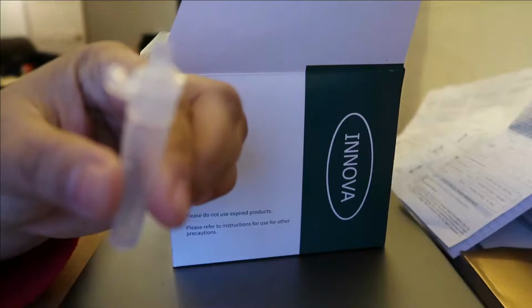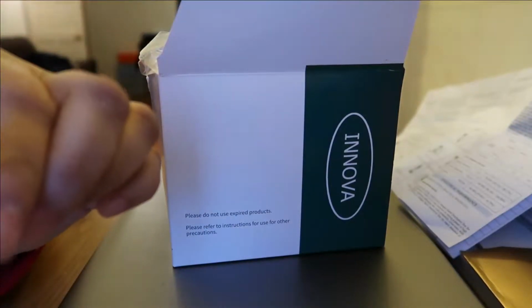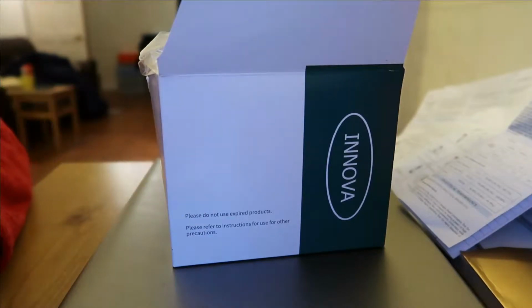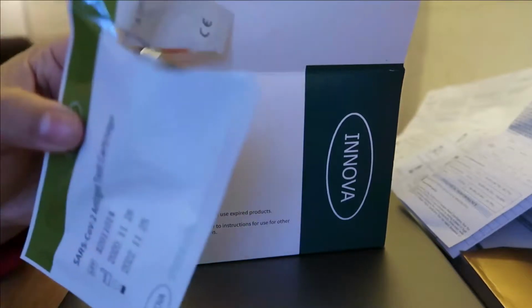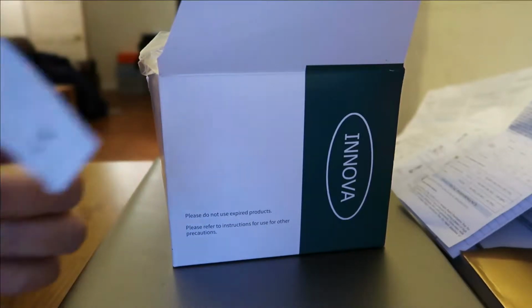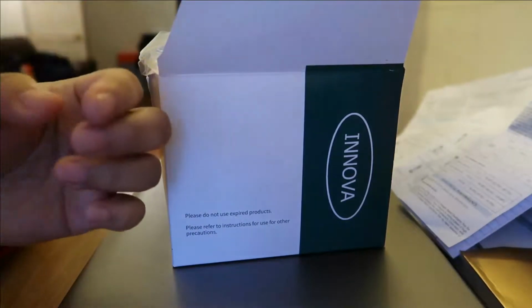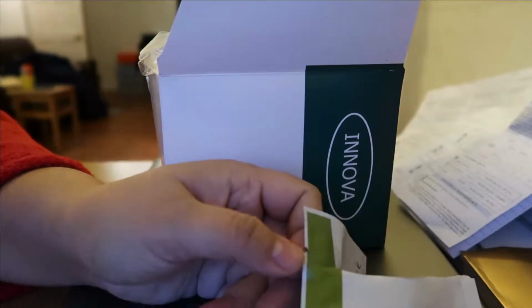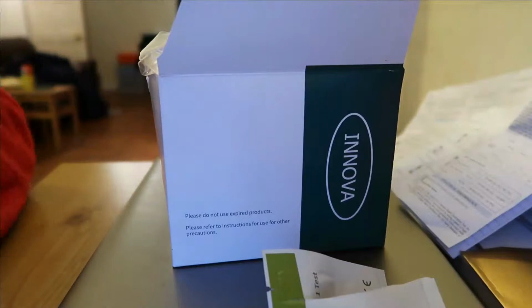To dispose of this, I put it back in the cartridge packaging, still not touching the edge of the nozzle, so that when I throw it away, I do not touch any of the liquid. Okay, so that's why I said you don't need to use gloves if you're very careful.